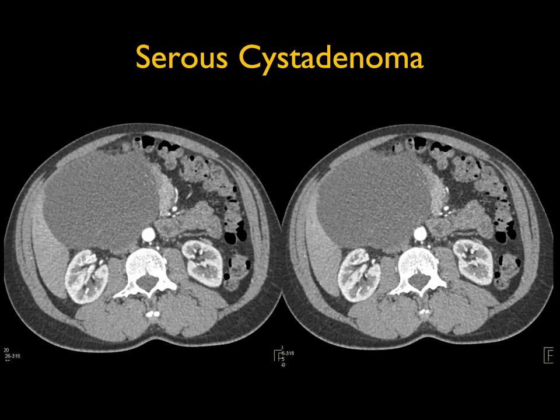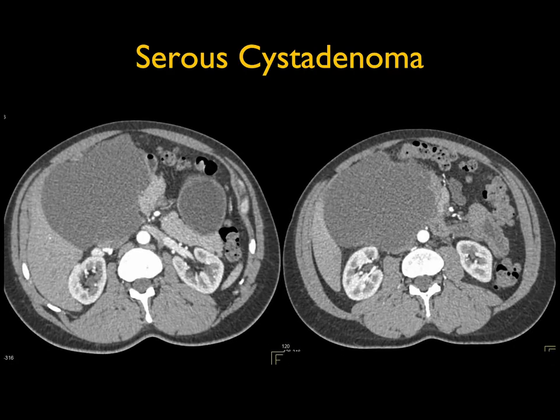In case number eight, there's a large cystic mass in the head of the pancreas. It's well defined — I don't see calcification, I don't see septations. I have to think first of a serous cystadenoma. I could not exclude a pseudocyst from pancreatitis without a history. A mucinous cystic neoplasm is considered, but they often have septations and are more commonly in the body and tail of the pancreas rather than the head.